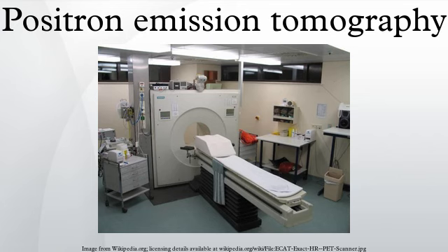Combination of PET with CT or MRI. PET scans are increasingly read alongside CT or magnetic resonance imaging scans, with the combination giving both anatomic and metabolic information. Because PET imaging is most useful in combination with anatomical imaging, such as CT, modern PET scanners are now available with integrated high-end multi-detector row CT scanners.